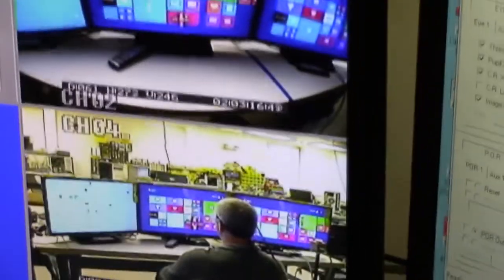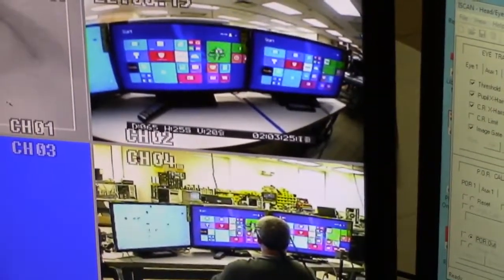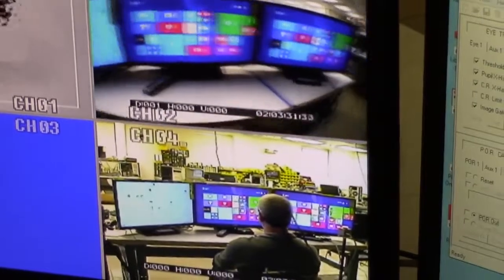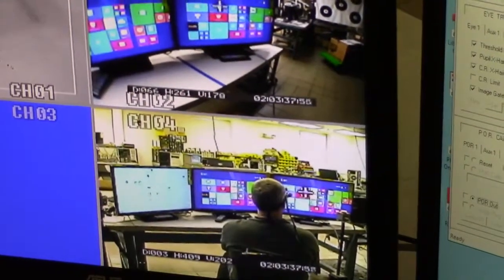So Pat, could you take a look at the green target in front of you on the first screen? Now you can see in the upper screen his point of gaze, and in the lower screen you see his integrated head and eye data. So now, Pat, go look at the green target on the rightmost screen. And you can see him looking at that. And then he can just look at pretty much anything all over these 3 screens.